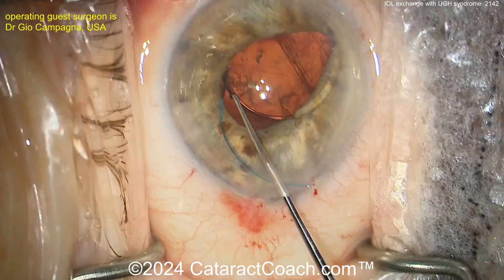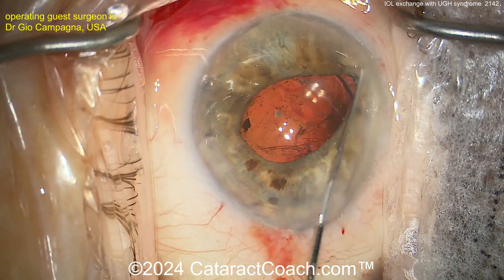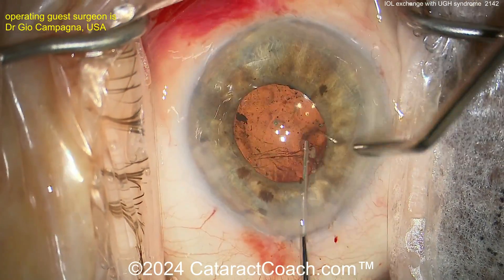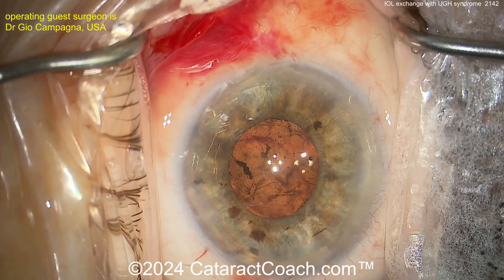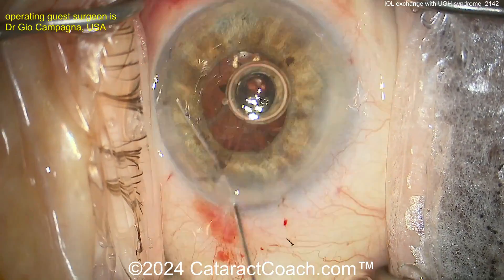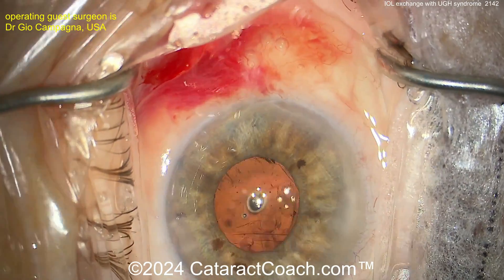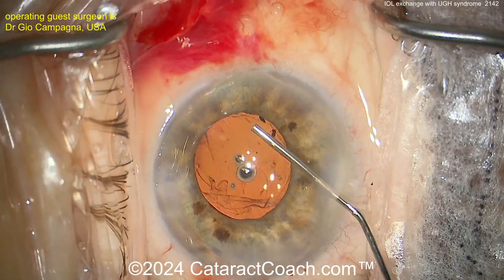This is an acrylic lens with a bit of a square edge — a little thicker. You may also want to consider a silicone lens, a three-piece silicone lens if appropriate. Confirming it's in the appropriate position. Not sure if you can do any optic capture here behind the anterior capsule edge or behind the posterior opening — if you can, that helps push the optic away from the iris. Unlike a single-piece acrylic lens where haptics and optic are totally planar, this three-piece lens has an angulation at the haptic-optic junction, usually 5 or 10 degrees, so the optic sits a little more posterior than the plane of the haptics. Looks like a miotic agent is being instilled to bring the pupil down.